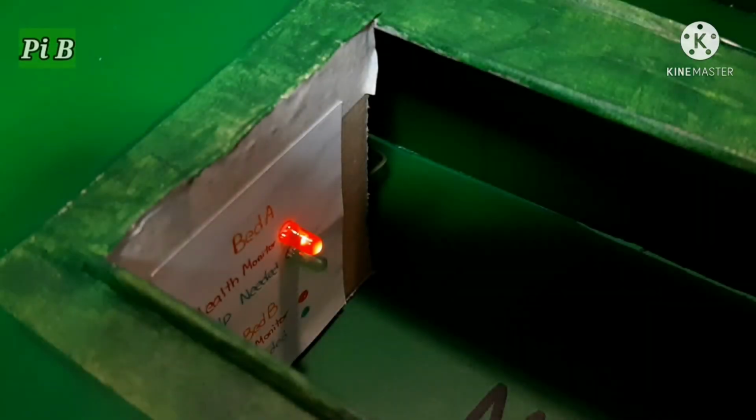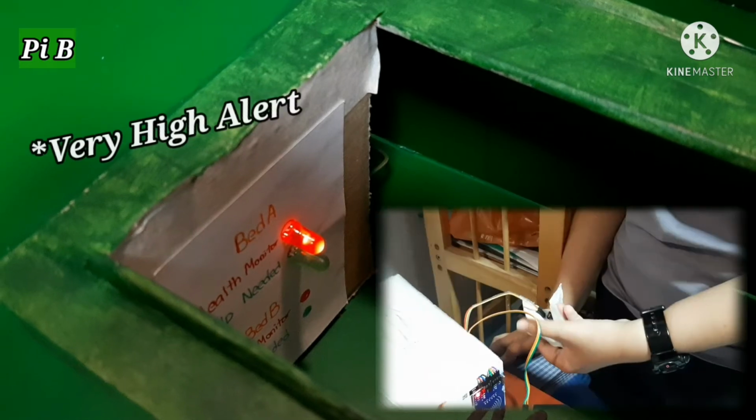If a patient's body temperature or pulse rate is very high, the LED will blink along with the buzzer in quick intervals. If it's moderately high, the interval will get slower. If the patient is healthy, there will be no alerts shown.